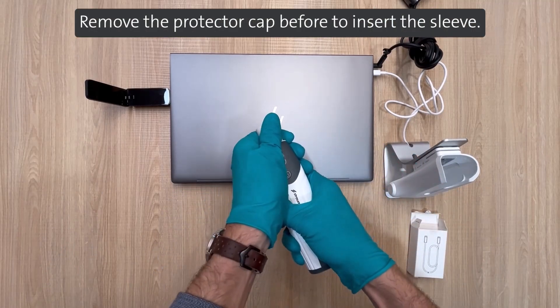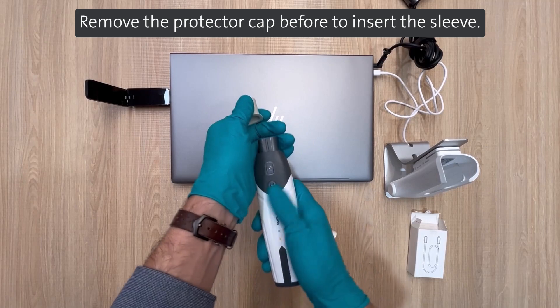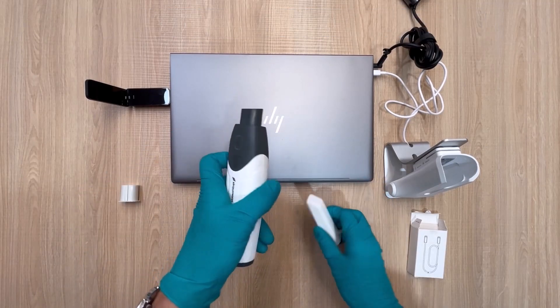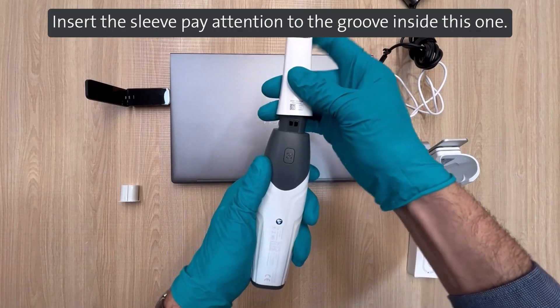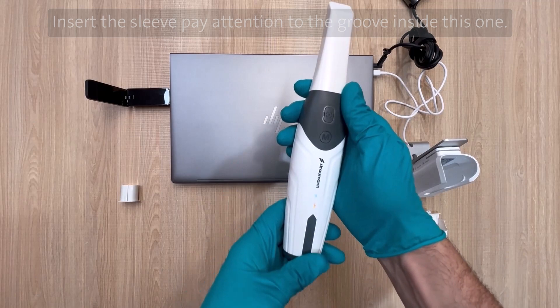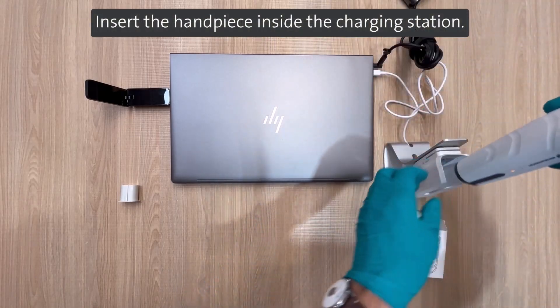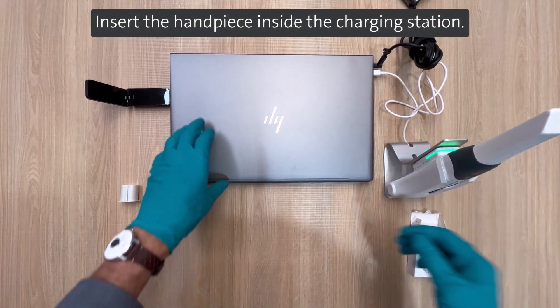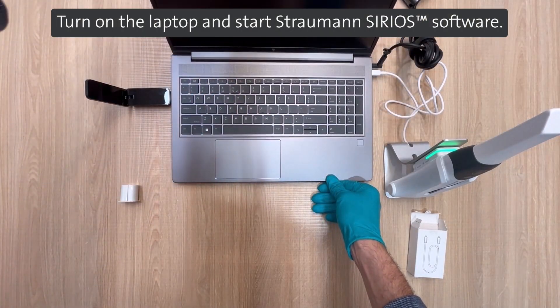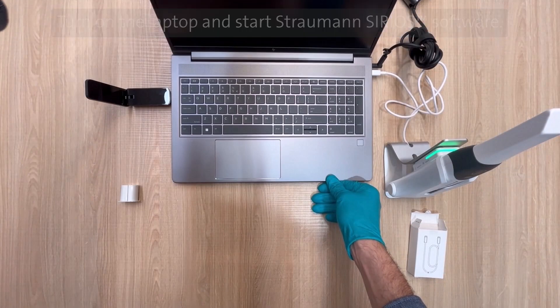Remove the protector cap before inserting the sleeve. Insert the sleeve paying attention to the groove inside it. Insert the handpiece inside the charging station. Turn on the laptop and start the Straumann SIRIOS software.